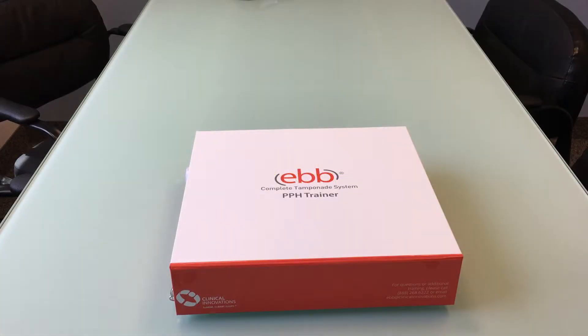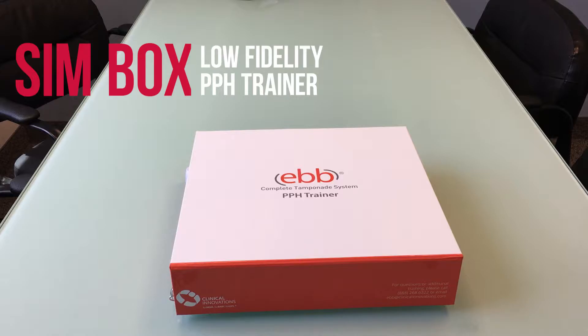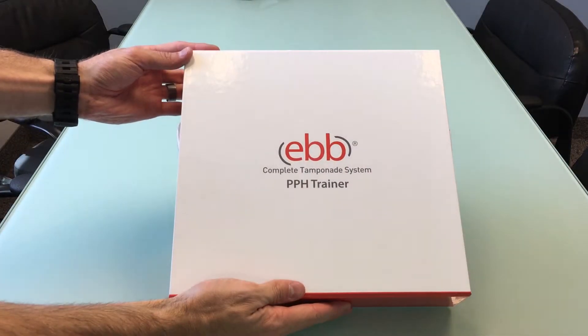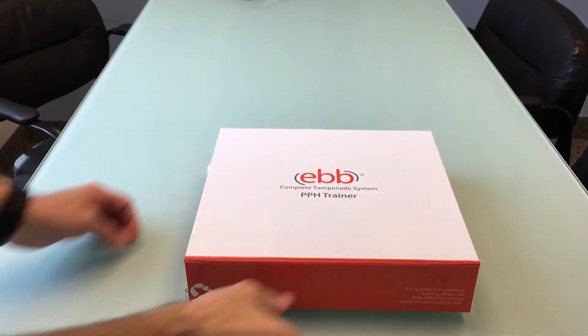Welcome to this brief training video on how to use your new EBB simbox. The box is a great low-fidelity simulator designed specifically to use during skills fairs or to help your clinical staff familiarize themselves with the EBB Complete Tamponade System.